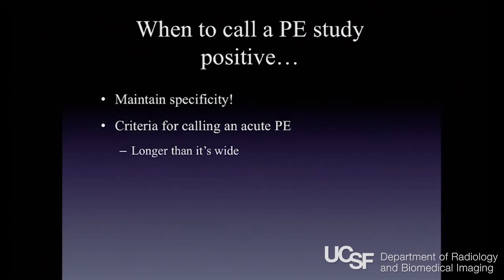So the goal is to maintain specificity. And these are our criteria for calling a PE. You must meet all these criteria. PEs are worm-shaped.